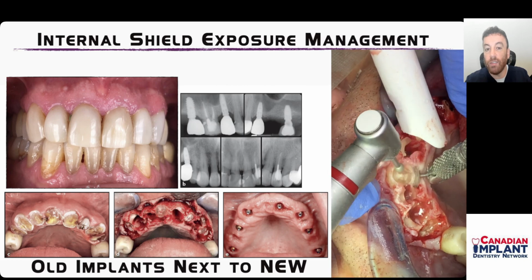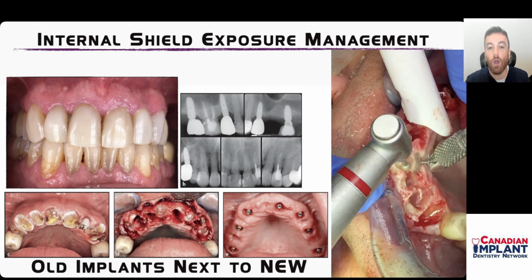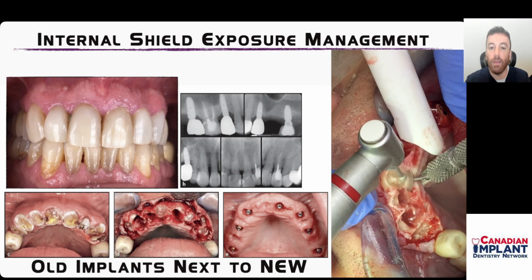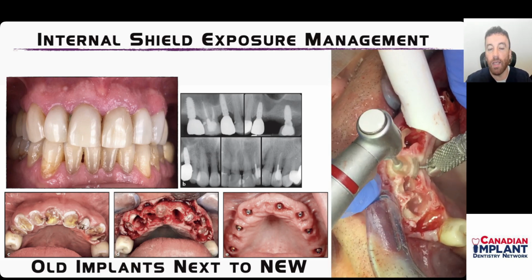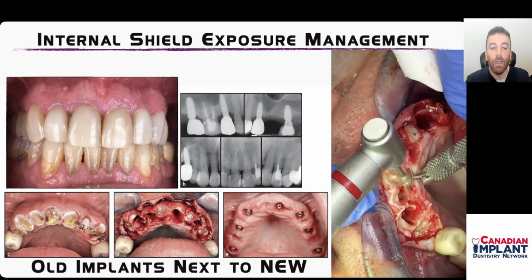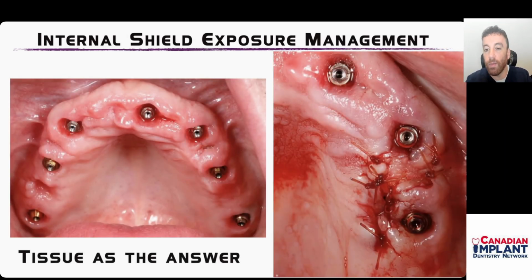Essentially, socket shield technique, although an amazing technique, still has some drawbacks. Now for me, these are manageable complications though. So I don't consider these as complete failures. So for example, internal shield exposures are very minor complications.